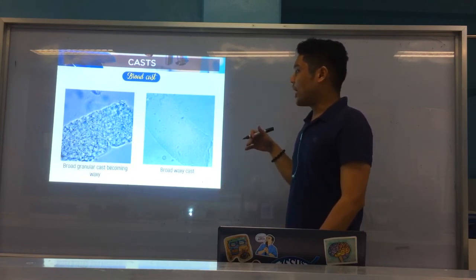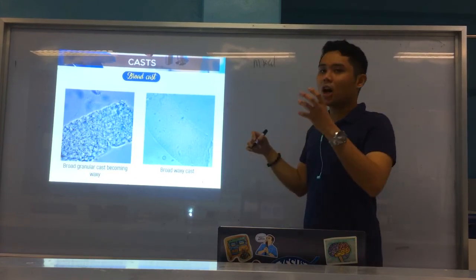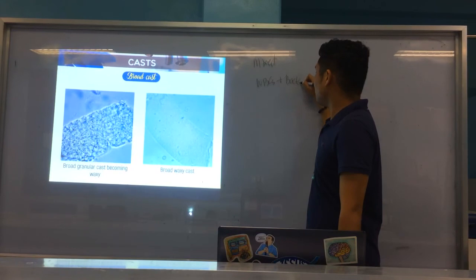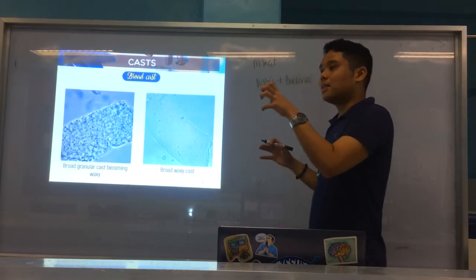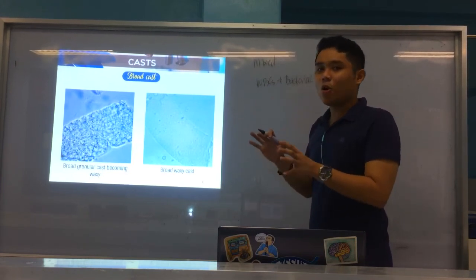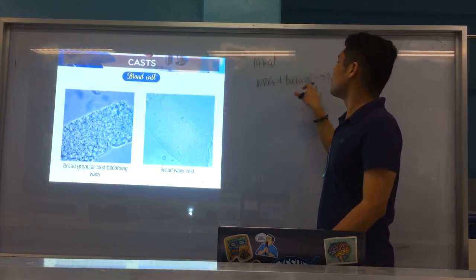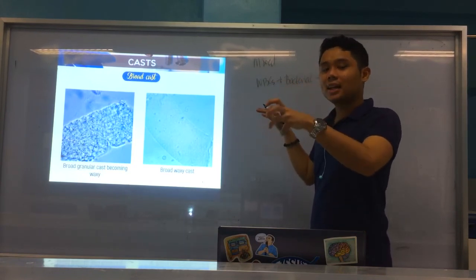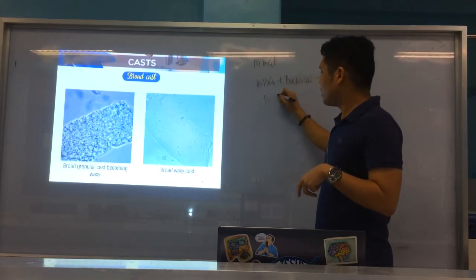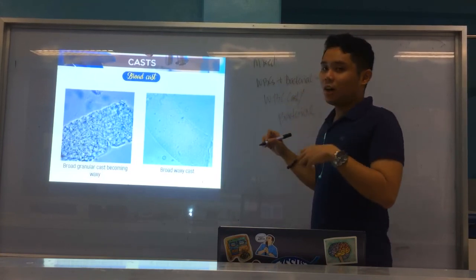Okay? Alright. And we also have the mixed cast, which was not mentioned earlier: mixed cellular, meaning there are two types of cells in one cast. For example, you have WBCs and bacterial casts. Usually they are incorporated in the same cast. But if you have a mixed cellular cast, you always have to find the predominant cast. So, for example, if you see a WBC and bacterial cast, which is mixed, you always have to look for a different cast that is predominant. So you have to look for a WBC cast or a bacterial cast. Meaning, only one cell is in the cast.